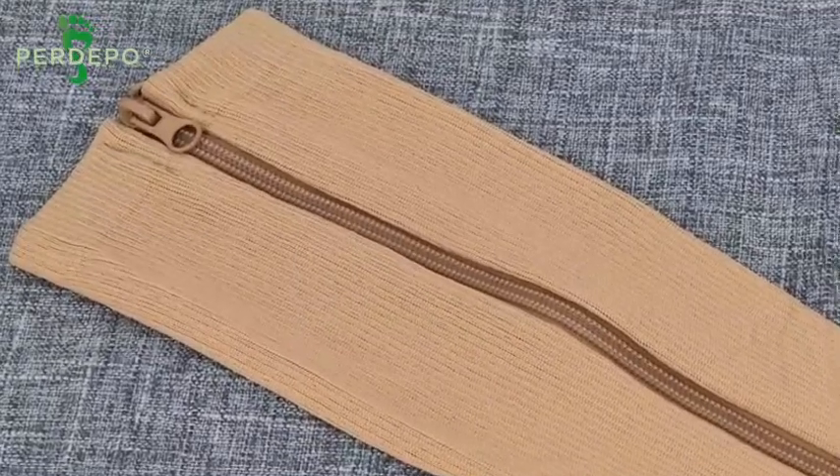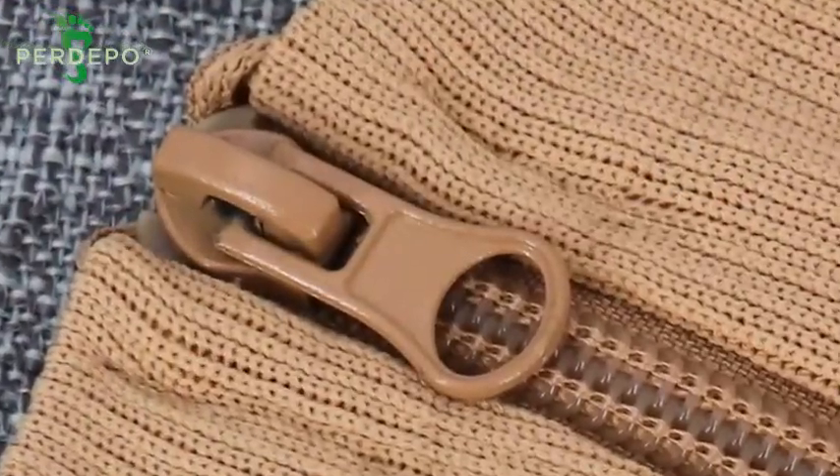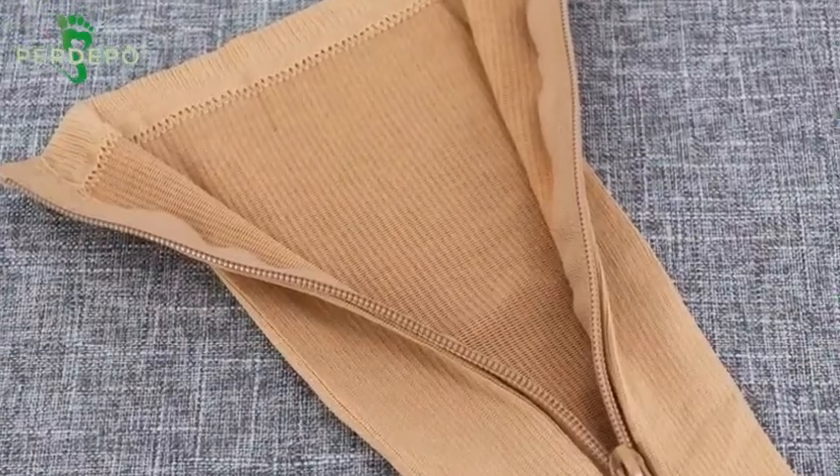As you can see, the sock has a high quality YKK zipper and a tab to make it easier to zip up.